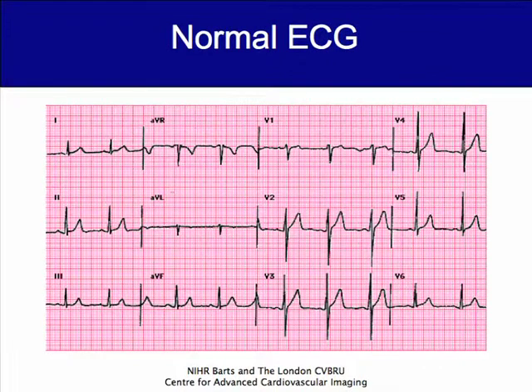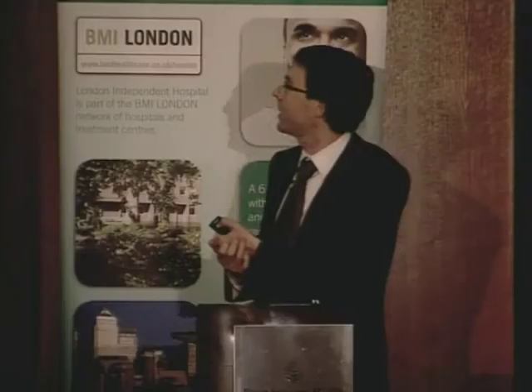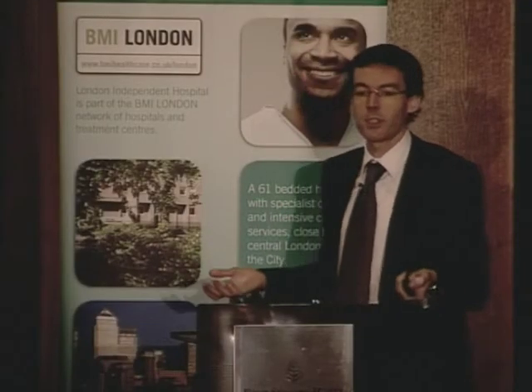This is a normal 12-lead ECG — a fairly standard configuration with the anterior chest wall leads and the limb leads. This is not a normal ECG. You can see totally disordered random electrical activity, and that's an ECG of VF. It's unusual in that it's a 12-lead ECG.